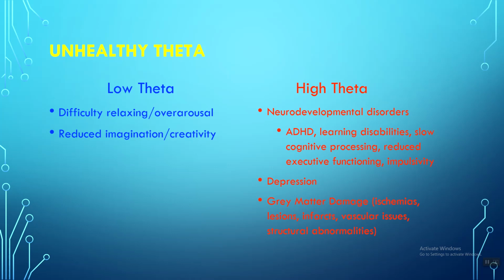One of the things to maybe hang on to a bit is the frequency can be in part the adjective that's used to describe the individual, right? So what that person is showing, at what age, is very important. What is theta? Theta is foggy, groggy, daydreamy, in a haze, not here, not present, not with it, not pulled together. And theta can also be highly creative. It really is an unconscious frequency, and so it is a frequency where, in my opinion, magic lies, and that's another lecture. It's a lot more fun.